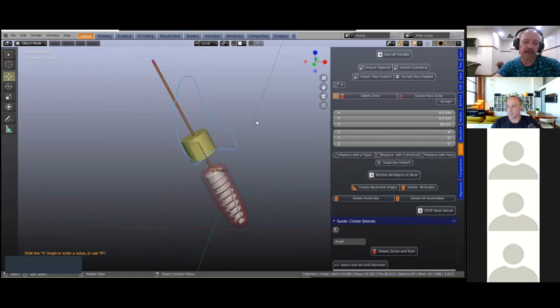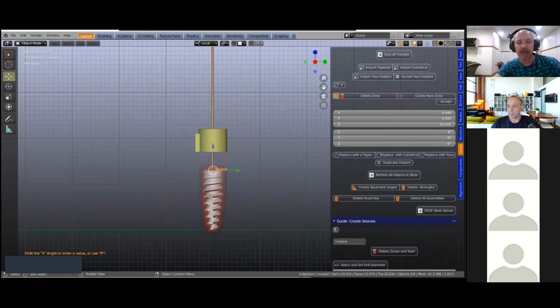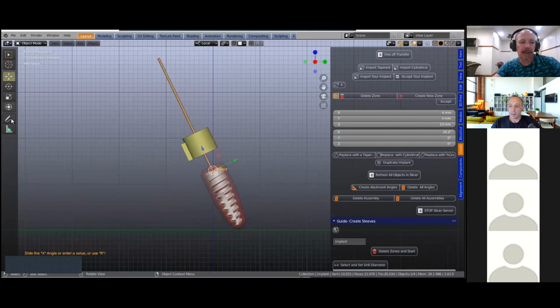Let's just view it from the other side. So we'll just view it from the right-hand side, assuming that's the buccal side. So again, can you explain the notch as well while you're at it? Yeah. So just say our tooth is like that somehow, hypothetically.